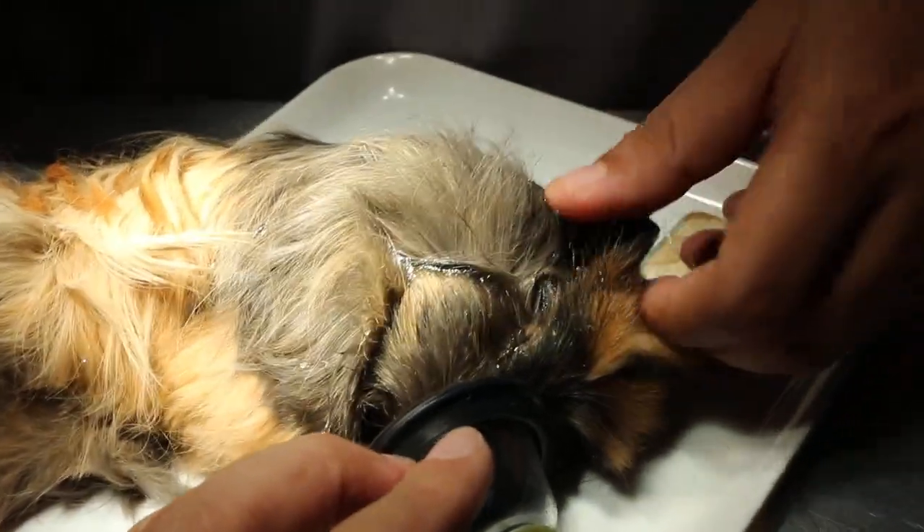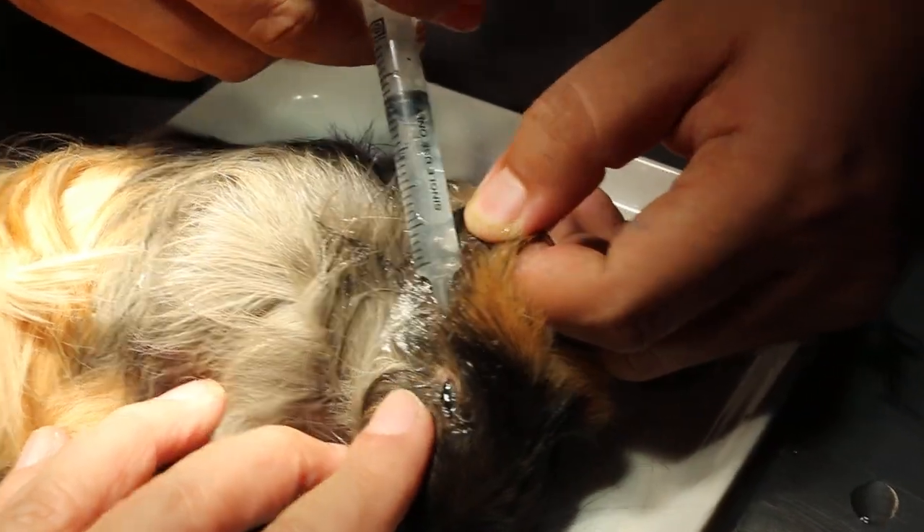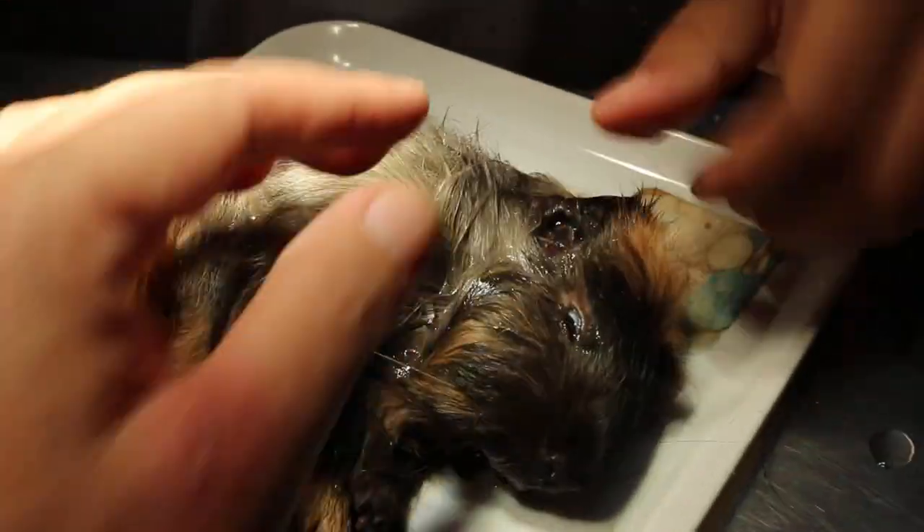We just clear the dirt — there's black dirt inside here. Cut down already. Massage the canal here, then the other ear.